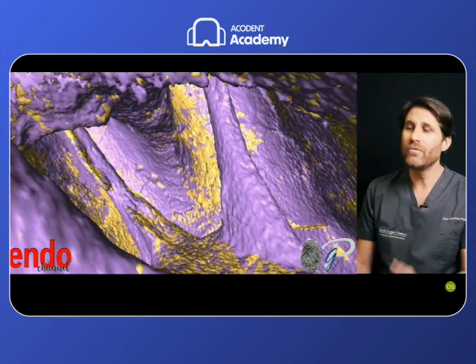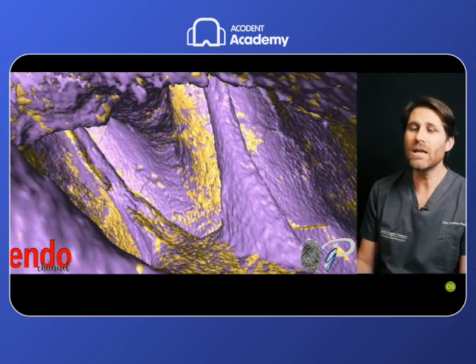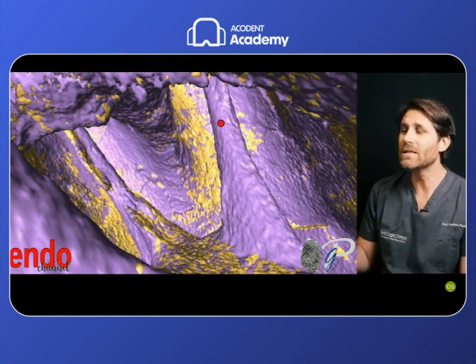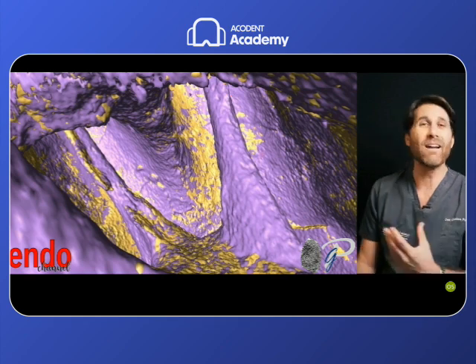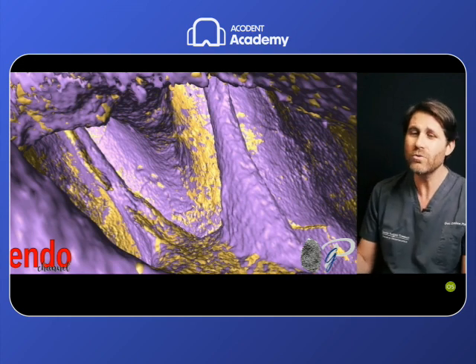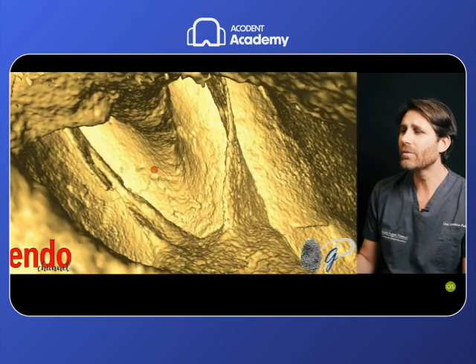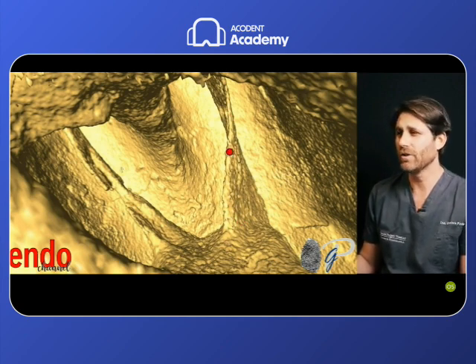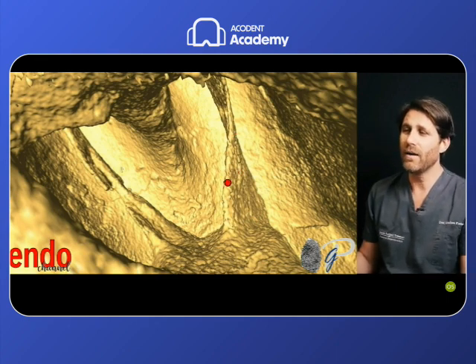We can remove this amount of dentin with ultrasonic tips, for example, but we need to go deeper inside the root, up to this level, 2, 3, 4 millimeters deep inside the root with aggressive ultrasonic tips, and I don't like to do it very much. So I use ultrasonic tips only up to this level, just to find the orifice and the invitation of the root canal. Of course, if the orifice is moved apically, as we have seen in the orifice location lesson, we have to go deeper with the ultrasonic tips.